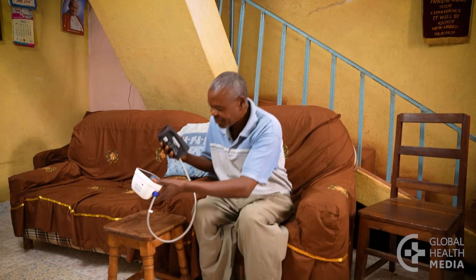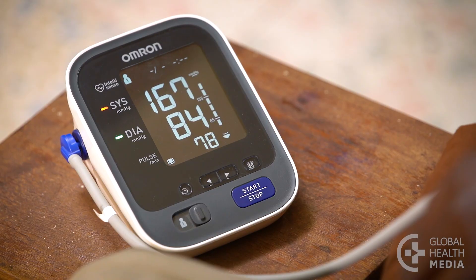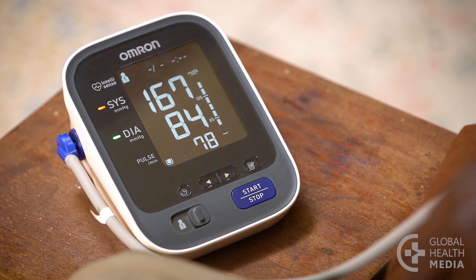Checking your blood pressure at home is easy and convenient. You can find out if you have high blood pressure, track your readings, and can see for yourself how lifestyle changes make a difference.